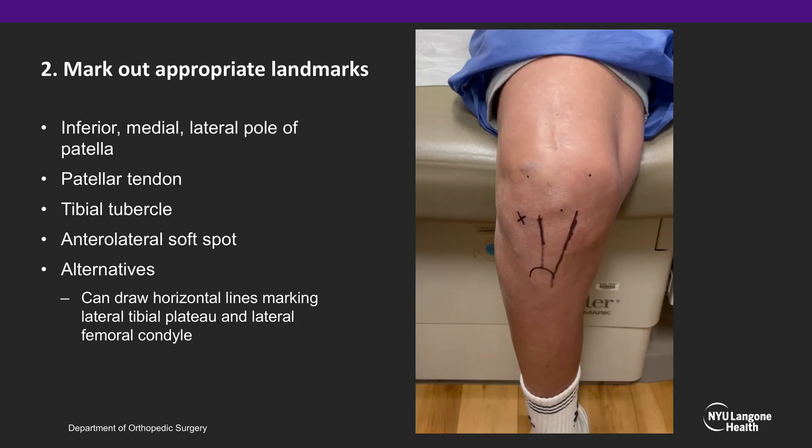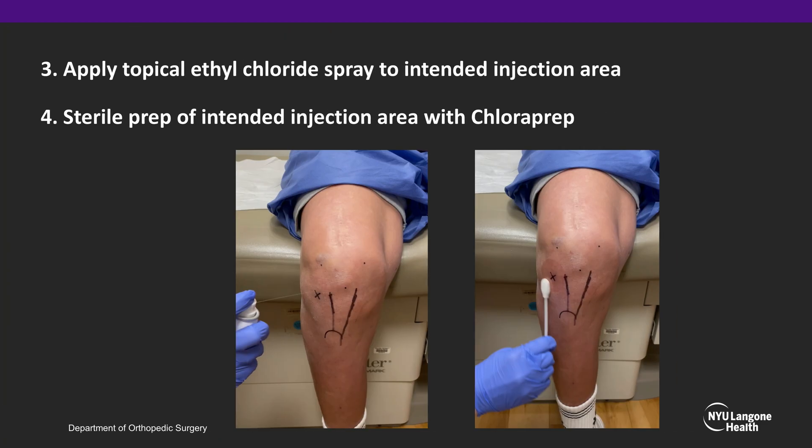Once appropriately positioned, mark out the appropriate landmarks using a marking pen, including the inferior, medial, and lateral poles of the patella, the patellar tendon, tibial tubercle, and your anterolateral soft spot. You can also draw horizontal lines marking your lateral tibial plateau and lateral femoral condyle if you wish. Next, apply topical ethyl chloride spray for analgesia, and then sterilely prep the intended injection site.